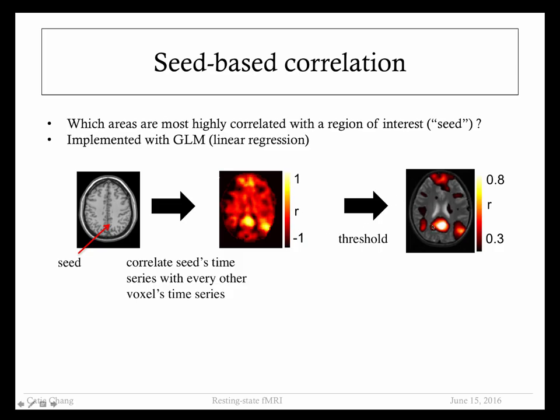And this can be implemented with pretty much the same linear regression framework as we use for task-based analysis, but here the regressor of interest will be the time course from that seed region of interest rather than your task regressors.